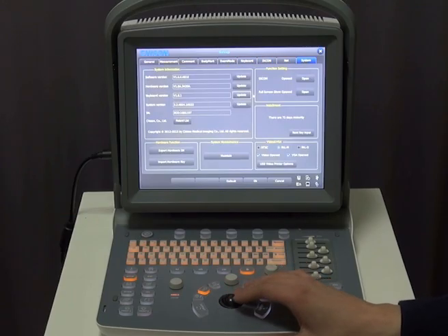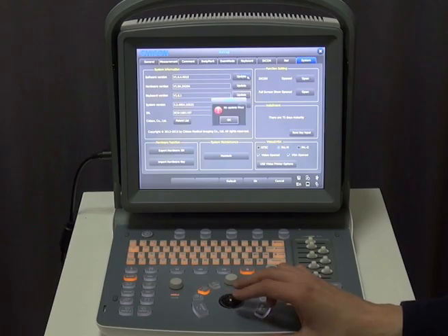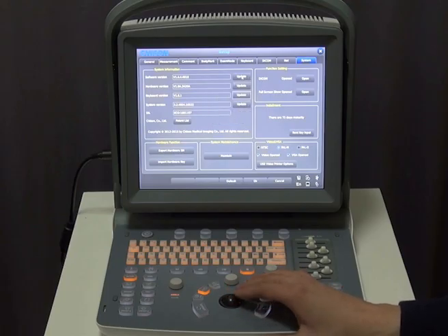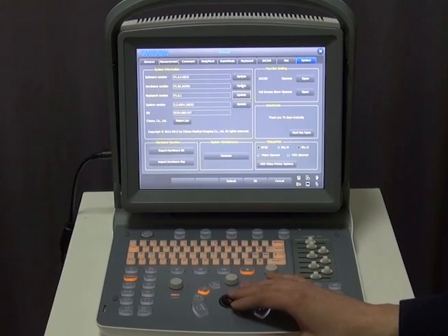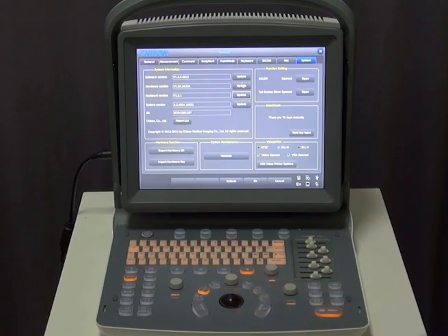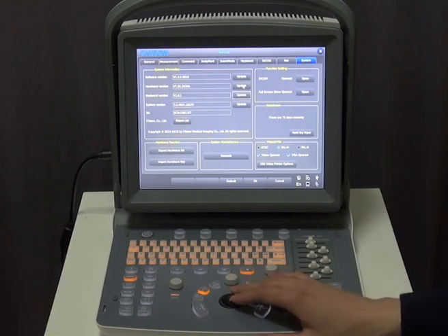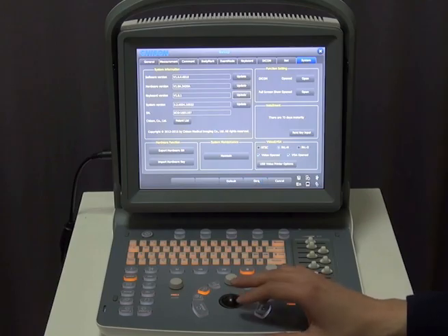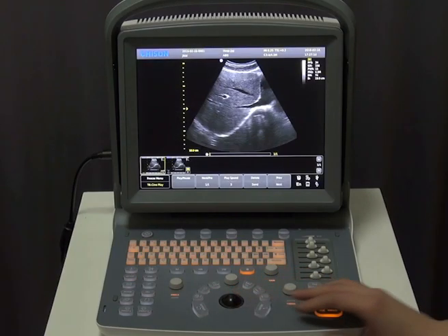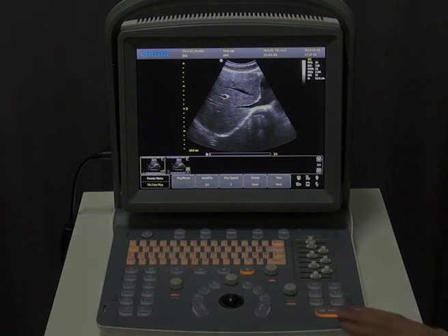Finally, we can update both software and hardware in System Information. Provide the serial number of your machine to us, and we will make the latest software and hardware. Then insert the USB to the system and click one key to finish the upgrade automatically. That's all — thank you.